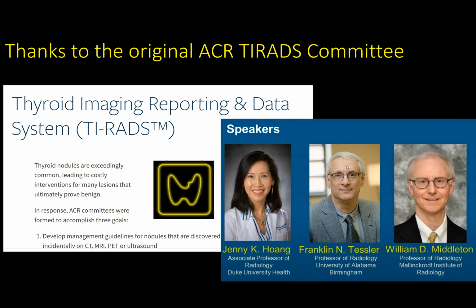But before I start, I wanted to give a big shout out to the original ACR TIRADS committee. I think they've done a phenomenal job here creating a new reporting system that can help add value to our radiology reports. The ACR website has some excellent online webinars to talk you through this reporting system and its lexicon. I highly recommend them. They are much more detailed and comprehensive than my short talk will be. There's also some PDFs with sample images of the appearances. A lot of those images will appear in my lecture today.